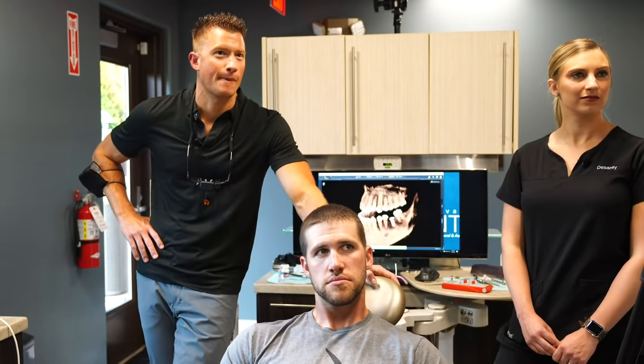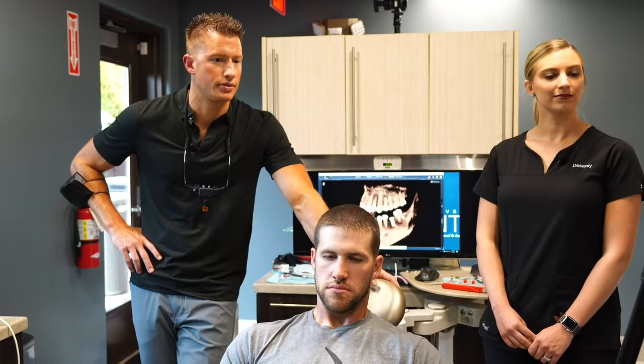What if your bone is too thin for it to fit an implant? If the bone is too thin, we can actually make it thicker. We can graft, and that's a very common procedure that we can do to add width to the ridge. Good question.